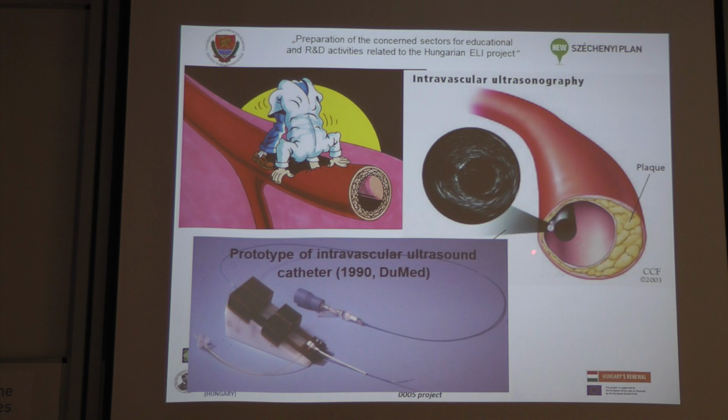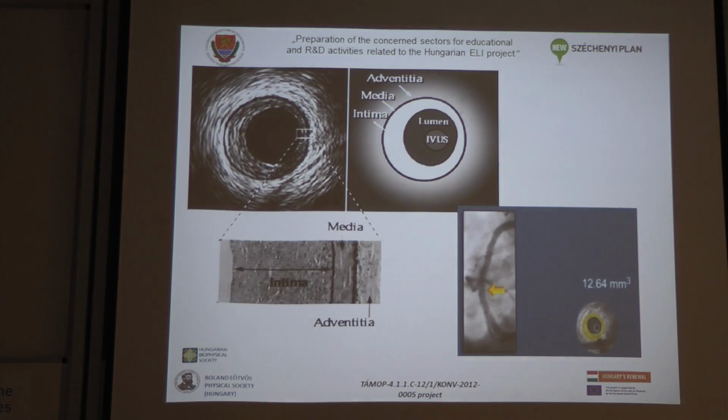But now it's really something which is quite frequently done in the cath labs. This intravascular catheter is really still expensive. It's around 500 or 600 euros, but sometimes it really helps and it's still used.